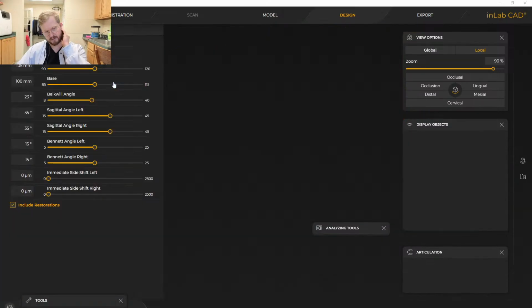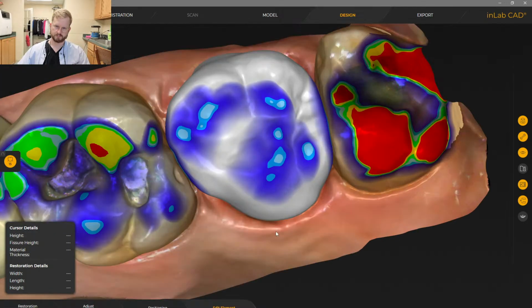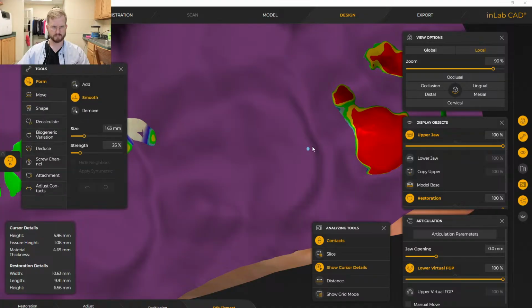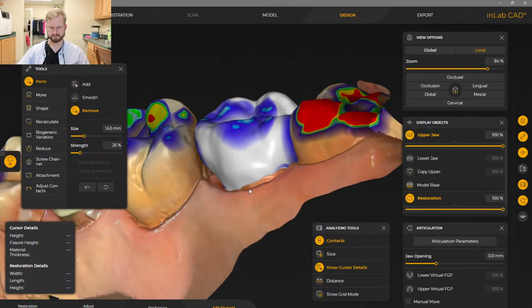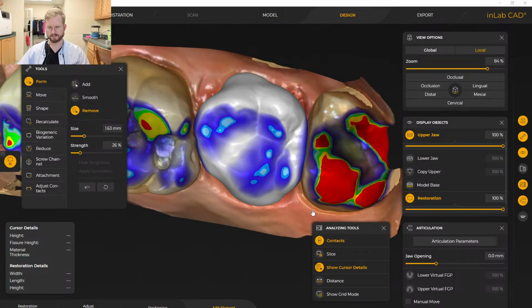Lastly, we'll check our articulator. So what happens when the patient's jaw slides around? This tool functionally generated that. Oh, there we go. That's our tooth.